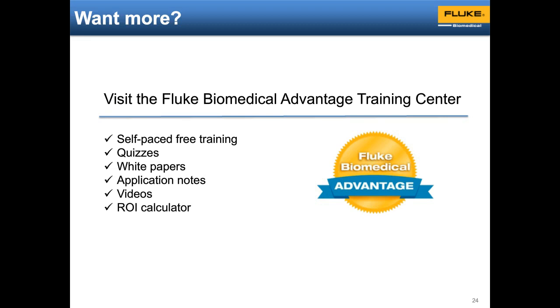Thank you. And how are R curves developed, and how many different R curves are there, and which R curves are the most frequent? That's a tough question. I've talked about how they're developed through these breathe-down studies in oxygen deprivation, and it's sensor by sensor. And there are what I believe are dozens of different sensor and firmware combinations from various manufacturers.